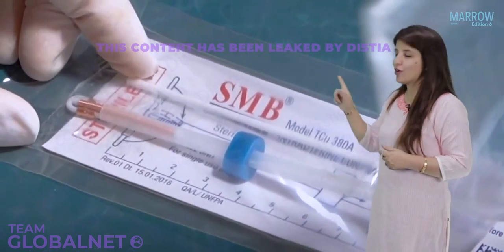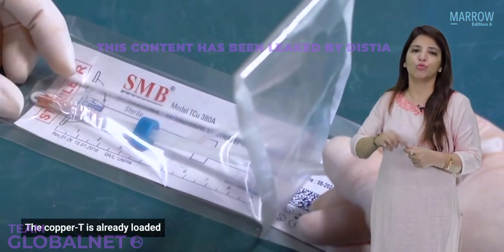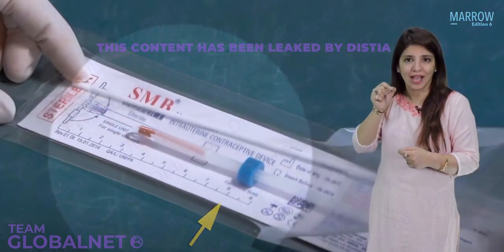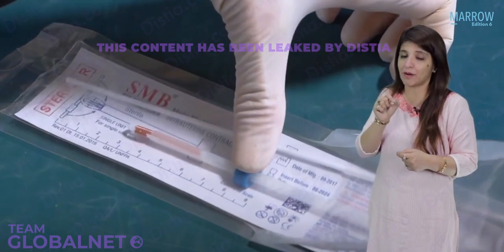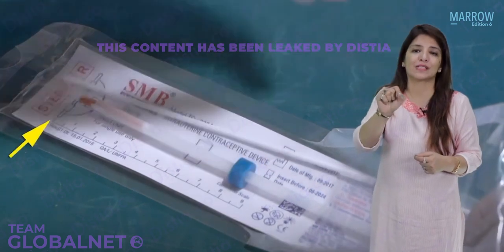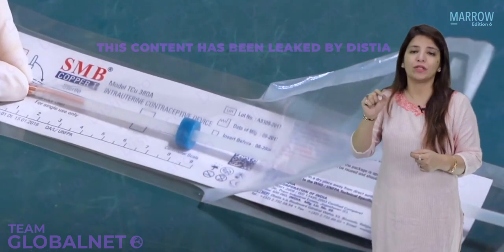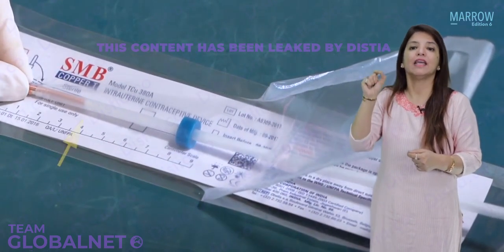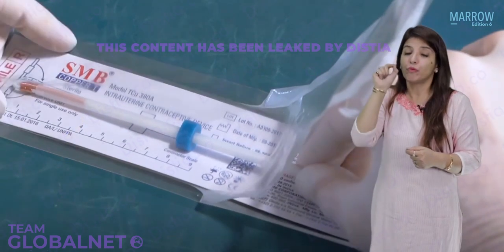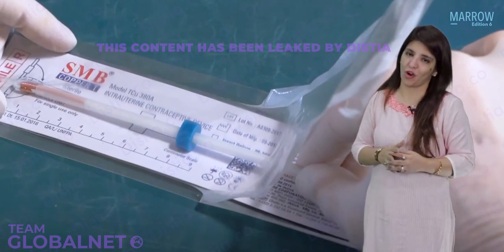So have you seen the loading of copper T? This is the loaded copper T. Now I am going to withdraw the loaded IUCD's inserter a little back so that the flange is lying at the 8 centimeter mark. I'm stabilizing it with my thumb and now I am pushing the inserter and the loaded IUCD forward again. Now with my other hand, I have taken the plunger and after stabilizing the IUCD, I am going to put this plunger inside the inserter rod. So this is how loading of copper T is done.